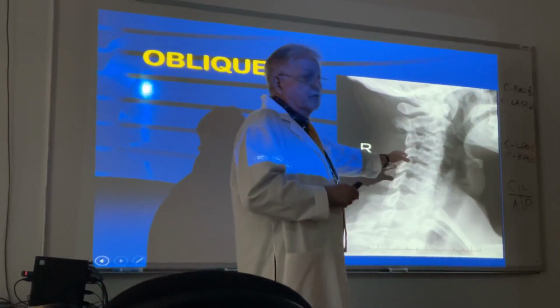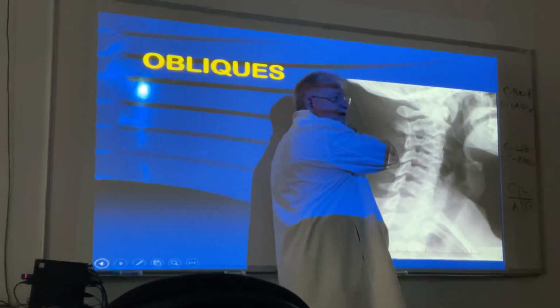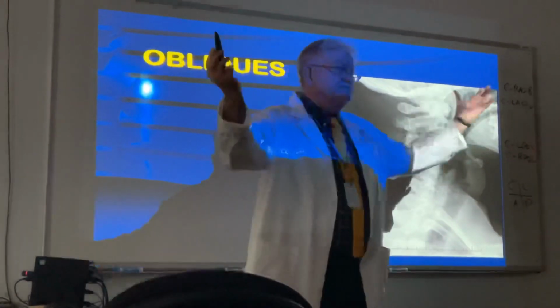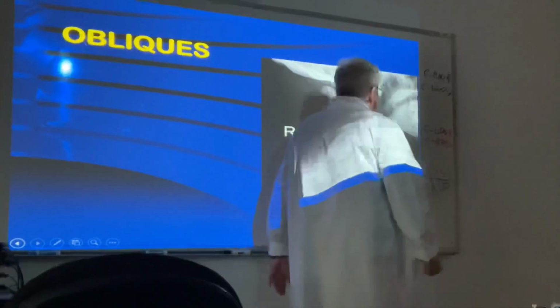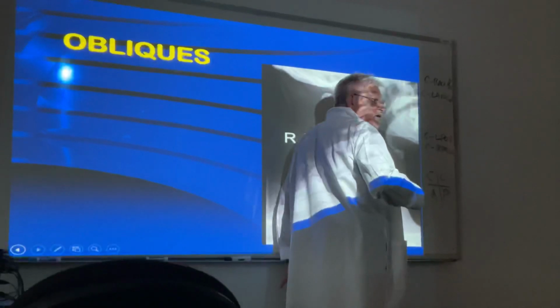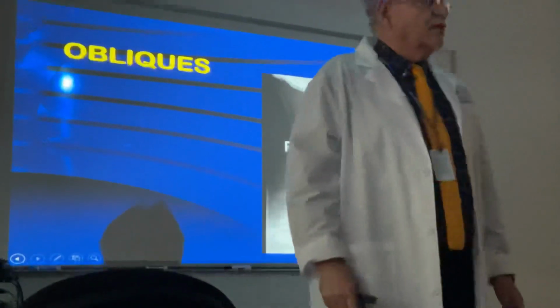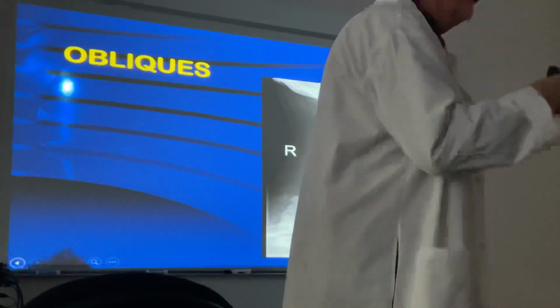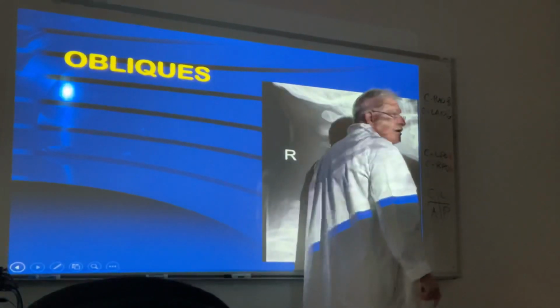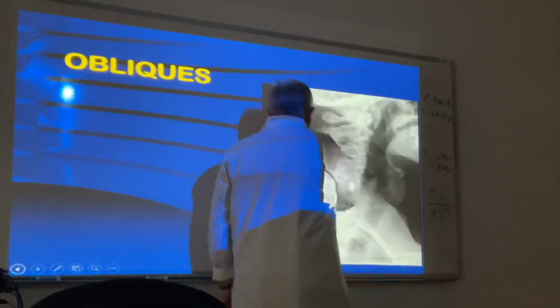All I can say is when I'm standing here, someone better put the left marker here if they're not. Let's say there's no marker there, and I don't know whether it's assumed this way, so this would be a left anterior oblique, right? But in the final X-ray, will your chin be exactly like that picture? But that's what I'm showing you, look. I'm going to position exactly how my chin's here, right? It's pointing towards that window, so it should have been left. This is the issue.